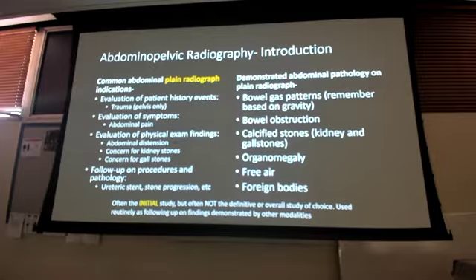If they're distended, if there's small bowel obstruction, if there's something called ileus, we're going to talk about all these things. You can see it on an x-ray. So this is why we jump to an x-ray first. It's quick, easy, and might give us the answer. Abdominal distension, yep. We'll evaluate for kidney stones and gallstones. Are we often going to see kidney stones or gallstones on x-ray? Probably not, but we will still do the picture just to make sure.